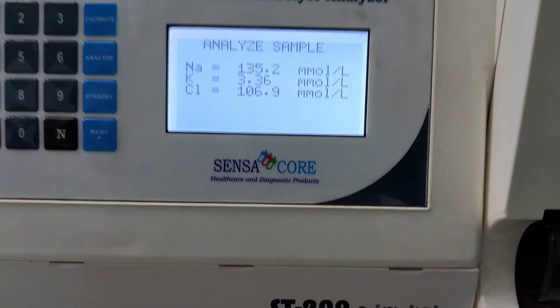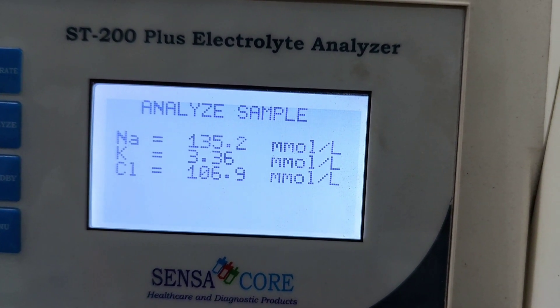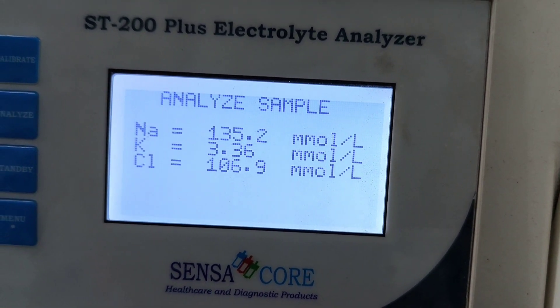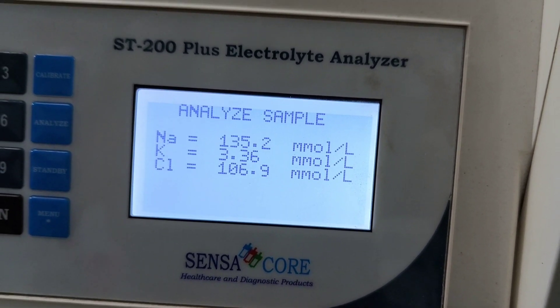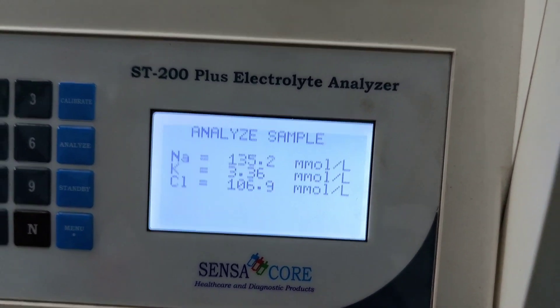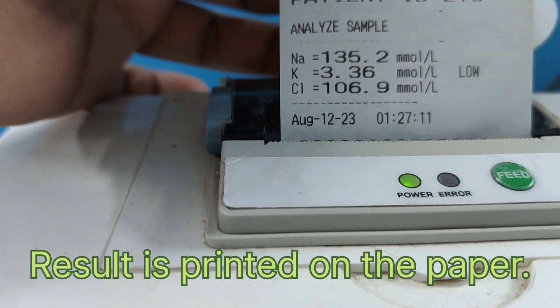Look at this — this is the result. Sodium 135.2 millimole per litre. Potassium 3.36 millimole per litre. Chloride 106.9 millimole per litre. And in this printer, it is showing there. Here is the result, printed.